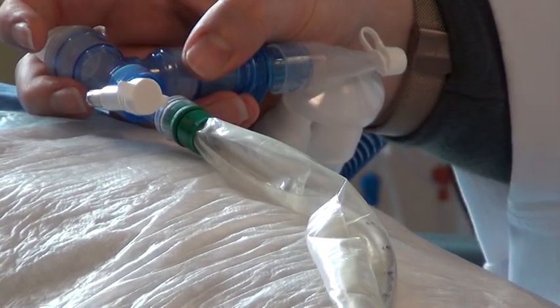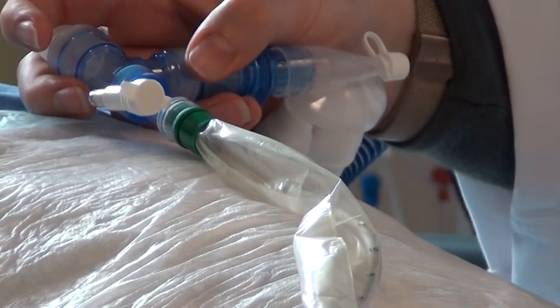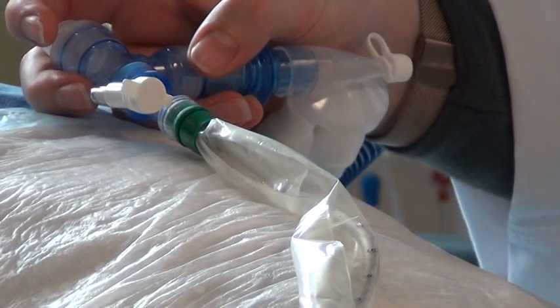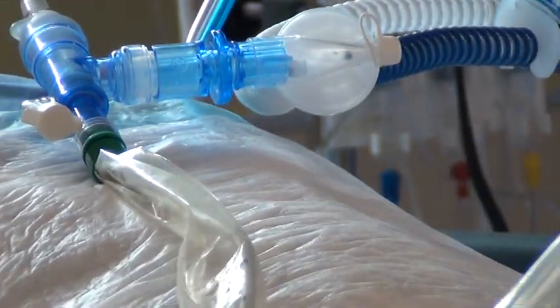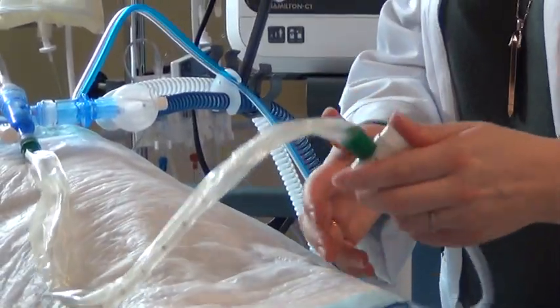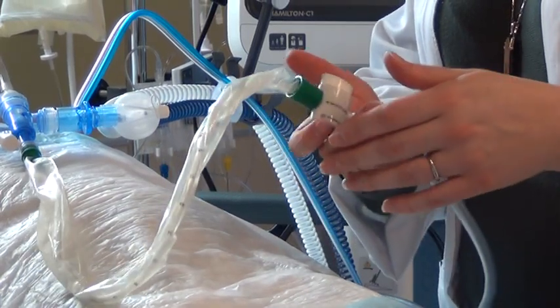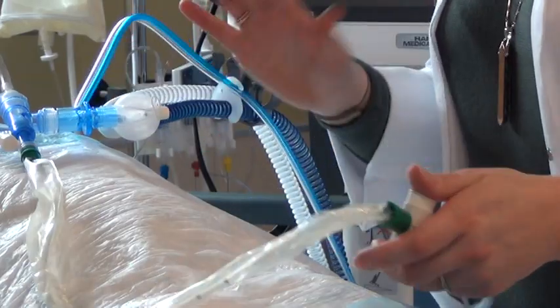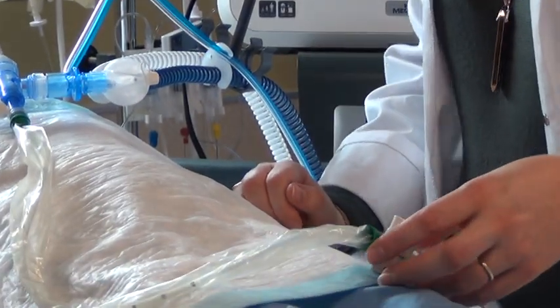So once we've done that suction, that's great. If we needed another one, we can go ahead after giving the patient a break. We can go and suction one more time. If we're done, we can just go here and lock our device to ensure that it doesn't accidentally get pushed down, and then we're actually just kind of sucking on the air that this ventilator is providing to our patients.